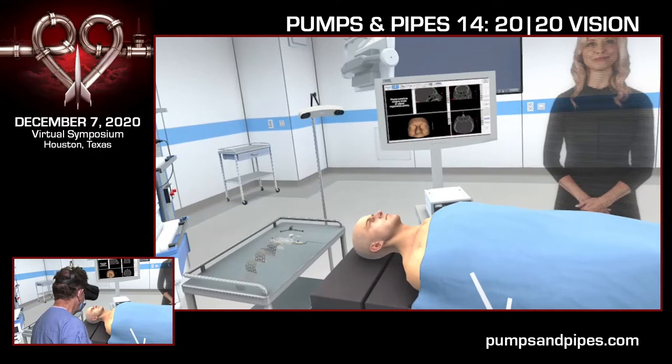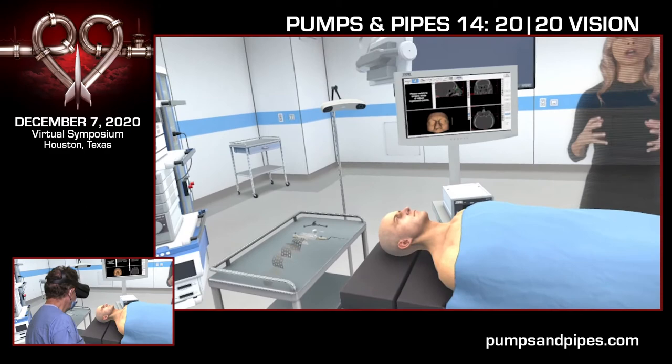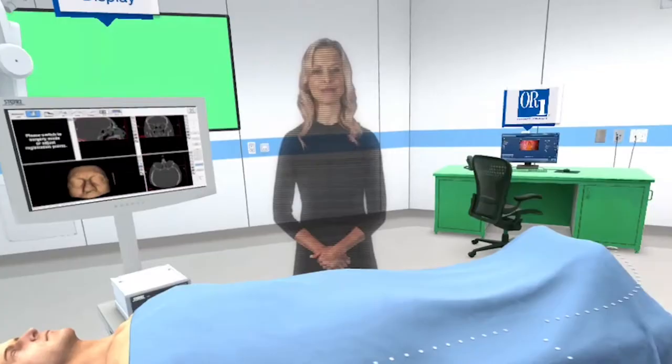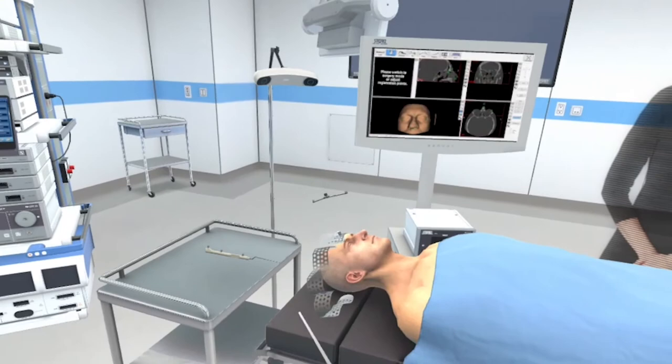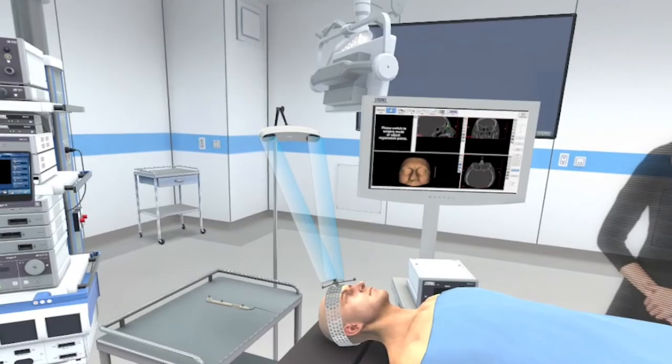Sinus surgeons are increasingly turning to image guidance systems. So I'm looking at the NAV1 system. It's something we're very interested in. The fact that this is portable and can be incorporated in a room, very good. These systems generate their guidance by superimposing live surgical data on the patient's pre-op radiology scans. Let's start by clicking on the reusable NAV1 headband and tracker to attach them. As with all optical navigation systems, a line of sight is required at all times. However, this technology is not affected by magnetic interference and is completely wireless.